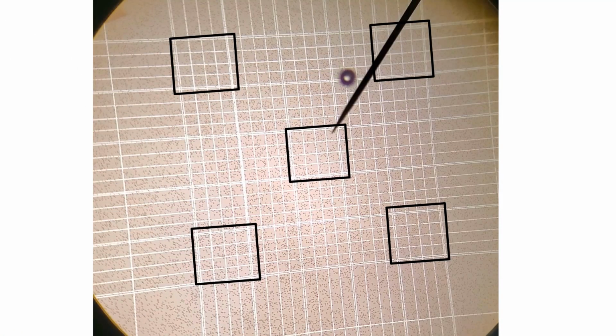So this is an image that shows the red blood cells spread out over the hemocytometer. And you'll notice that there are a ton of them. It would take a very long time and probably give you a substantial headache if you tried to count every single red blood cell that you see in this image.